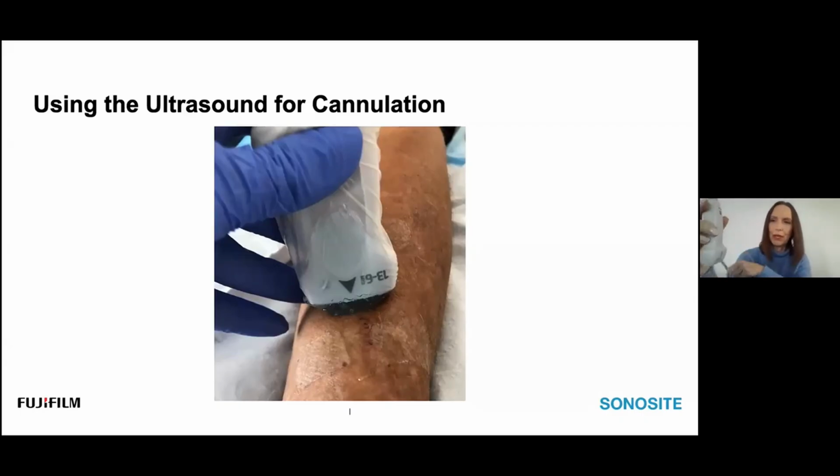So when you hold the probe, a light touch is most important, especially when you're doing vascular access. If you push too hard, you're going to collapse your vessel. So the closer you hold down to the end of the probe, and as Adrian's saying, if you can at least anchor 1 or 2 fingers on the patient's skin, it will keep the probe from drifting off to one side or the other. It also allows you to hold the probe lightly so as not to compress the vessel, and it allows you to turn the probe in different directions without moving around too much. So if we can keep at least a couple fingers on the patient, we also want to make sure that you keep the probe perpendicular.